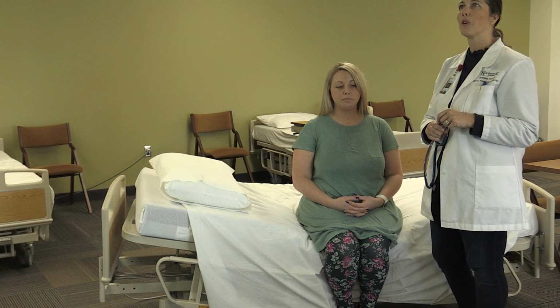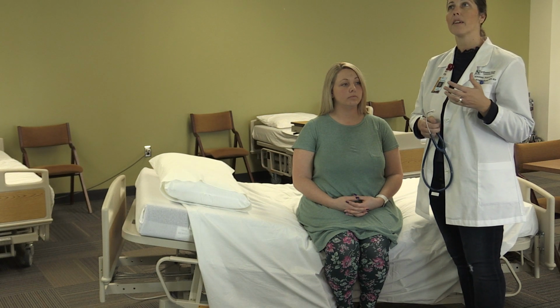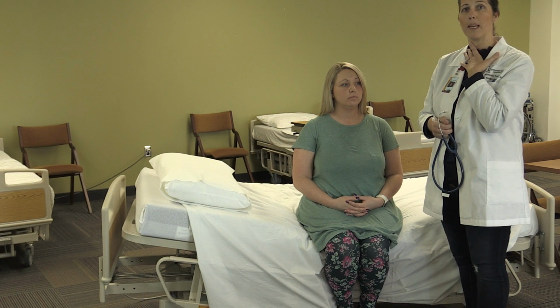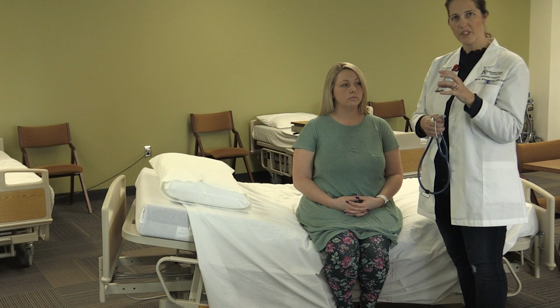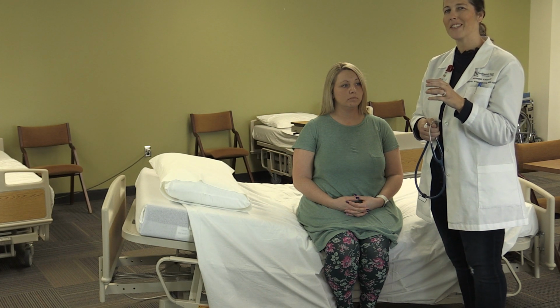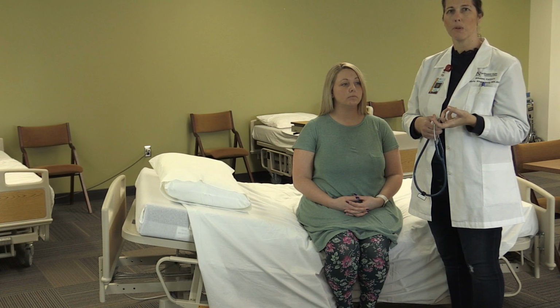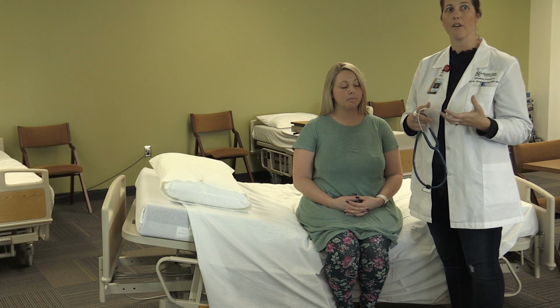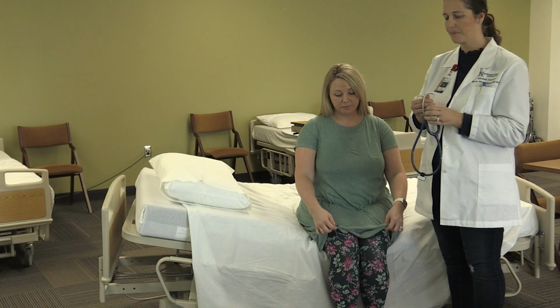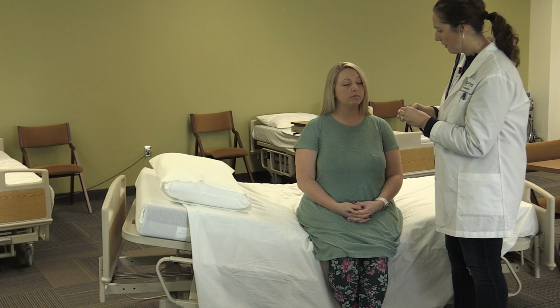The next thing that you're going to do is I'm going to go ahead and auscultate the carotid arteries for any bruits. When we listen for bruits, we're listening for that swooshing sound. We actually don't want to hear that. That would indicate kind of a turbulent flow of blood through the arteries. Could be a potential concern for narrowing of the carotid arteries. So if you don't mind, I'm going to go ahead and listen to your carotid arteries.